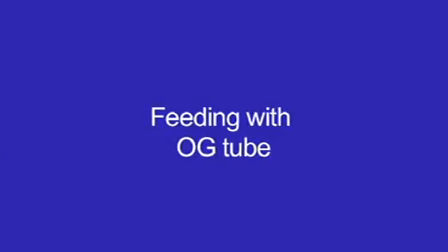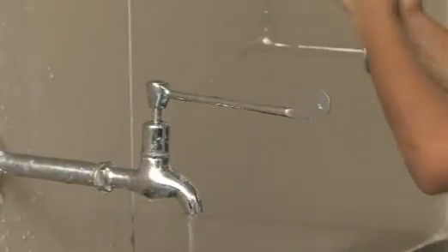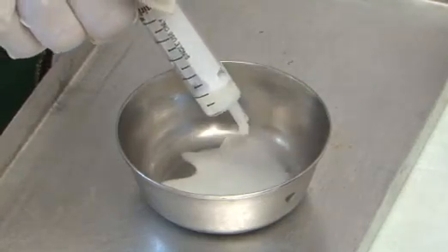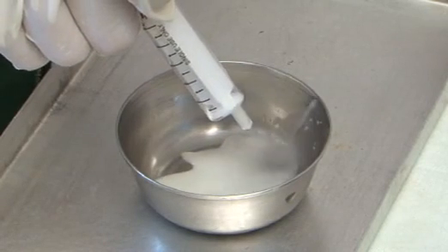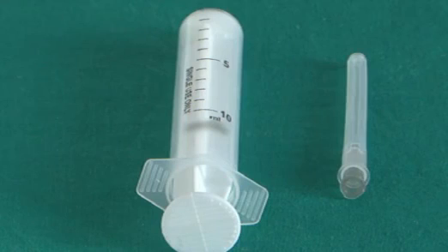Feeding with orogastric tube: Wash hands properly. Take the required amount of feed in a clean bowl. Ensure the orogastric tube is in the stomach by noting the point of insertion at the angle of the mouth and cross-check with that recorded in the chart.